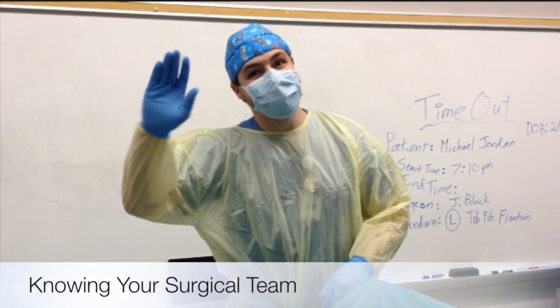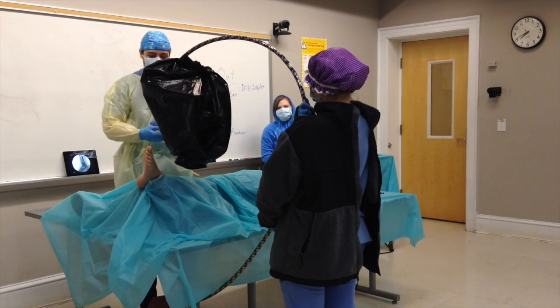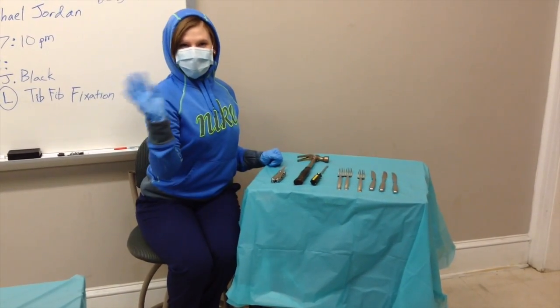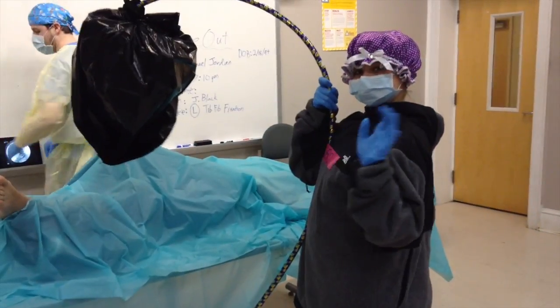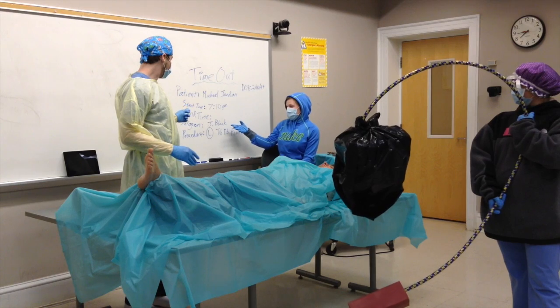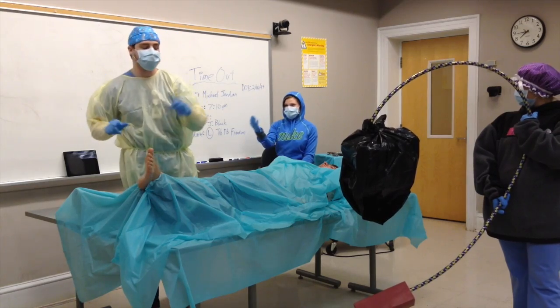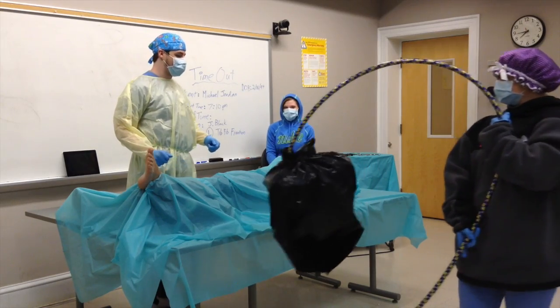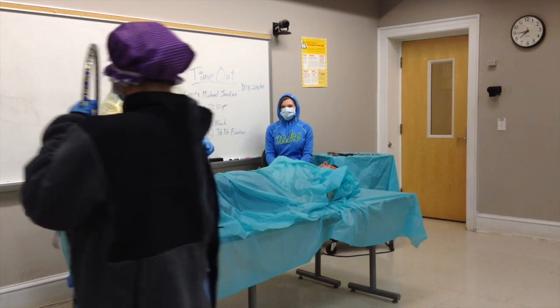Knowing your surgical team. Knowing your surgical team is just as important as knowing your own equipment. The surgeon, the certified surgical technologists and nurses, as well as the patient are all on your team as a radiologic technologist. Upon walking into the room, the first task that the surgical team should complete is confirming the ID of the patient and which exam needs to be done. After confirming the patient's ID, the radiologic technologist should perform the exam quickly and accurately while having good communication with the surgeon so that he or she can continue operating.